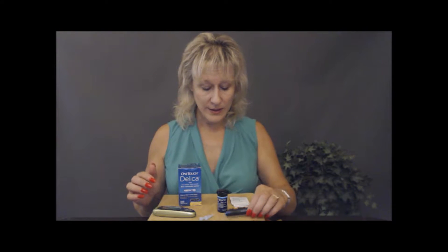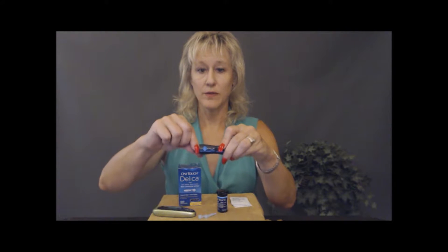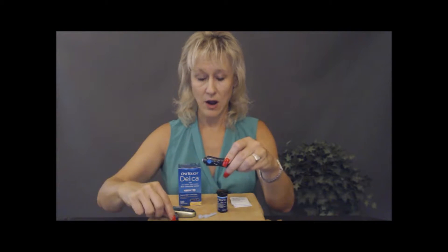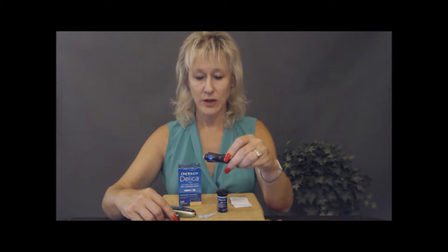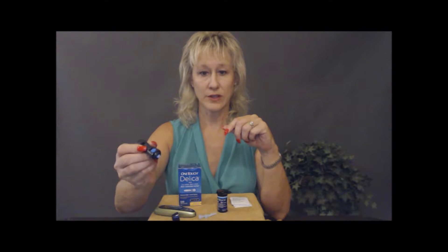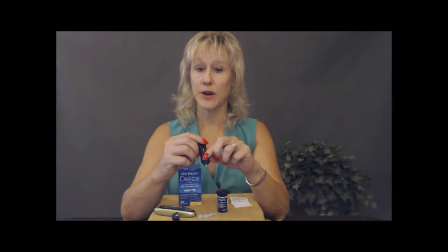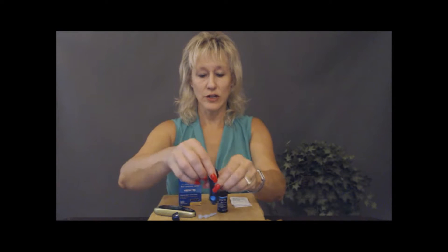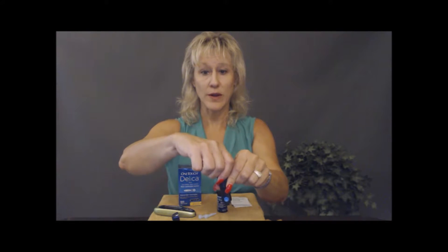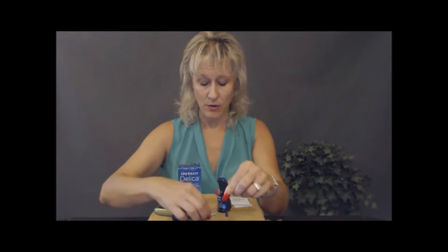Let's start from the beginning and change out the needle. You're going to twist off the top — most all of these lancets work in a similar fashion. Never have this near your face; keep it away from anyone else and do this in a private area if you can. When you eject, eject downward so it's away from you. And you see how the needle just popped right out.